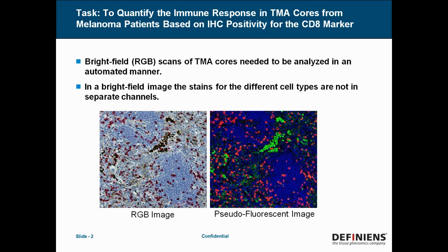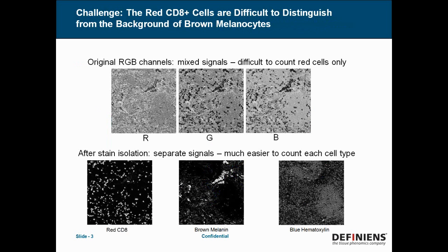Now in a brightfield image, the chromogenic stains for the different cell types are not in separate channels the way they would be in a fluorescent image, and this is shown down at the bottom of your screen. On the left-hand side, we have the brightfield image which is made up of red, green, and blue channels. And on the right, we have a computer-generated pseudo-fluorescent image which is sort of our end goal in this project. The challenge is that the red CD8 positive cells are difficult to distinguish from a background of brown melanocytes, because this is skin samples.